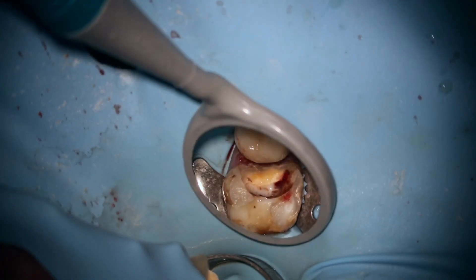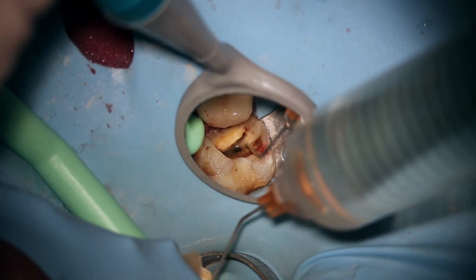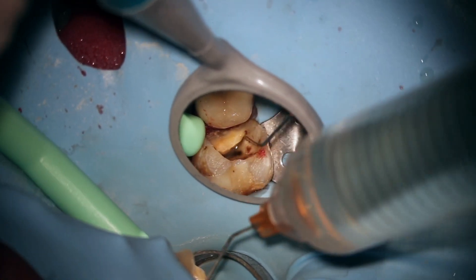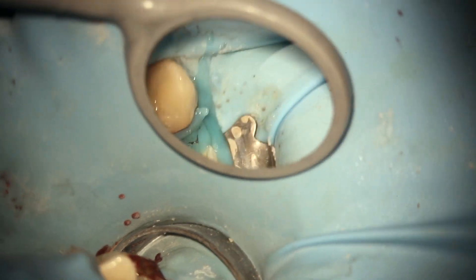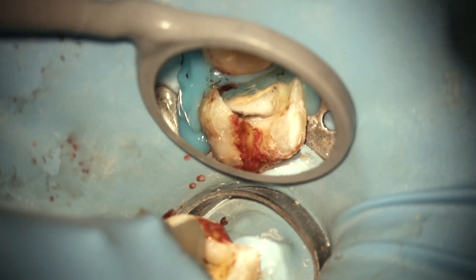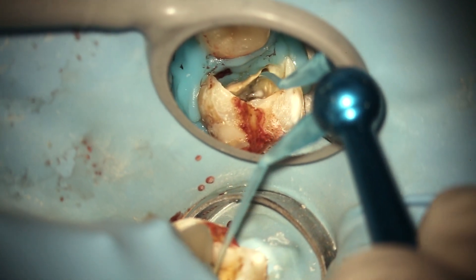Use the ProTaper Gold SX to open the coronal third, then why not open the middle third with a middle flare? The middle and coronal flare help you negotiate to patency. Always — always — irrigate with sodium hypochlorite 5–6% after any shaping file, and then recapitulate when shaping. But right now we haven't recapitulated because we haven't even gotten a working length yet.